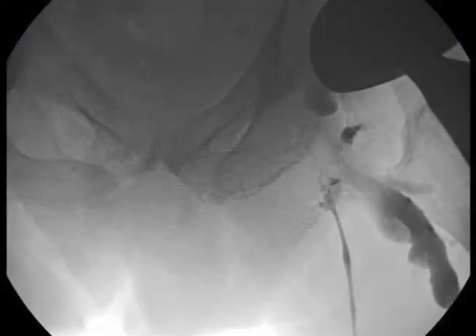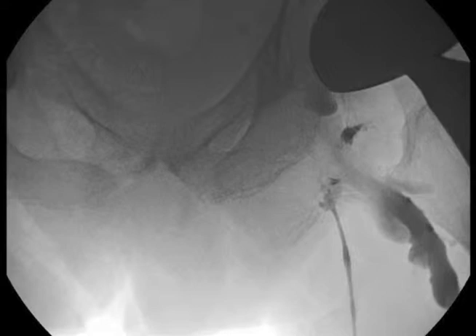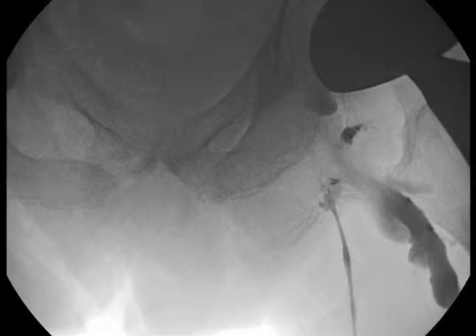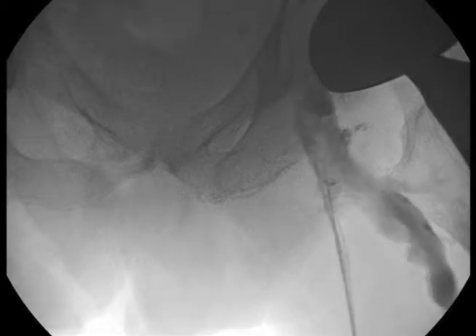In this diagram we see a phlebogram in which the laser fibre has been inserted up to the sapheno-femoral junction. Contrast has been injected to demonstrate the position of the laser fibre in conjunction with the sapheno-femoral junction and its communication with the deep venous system.